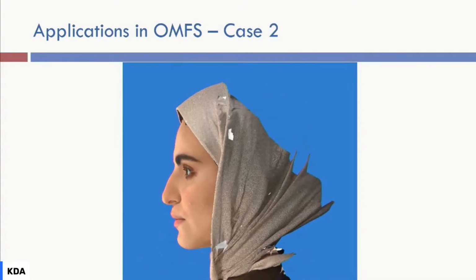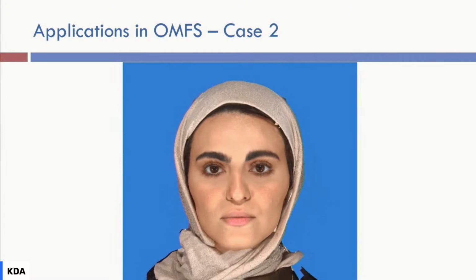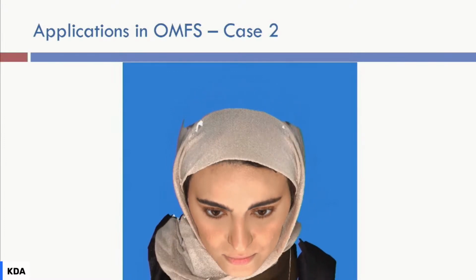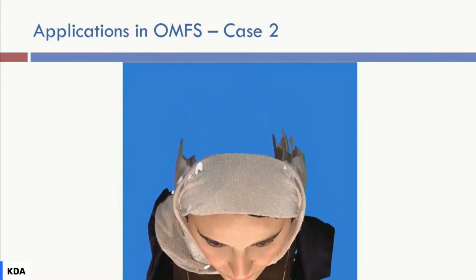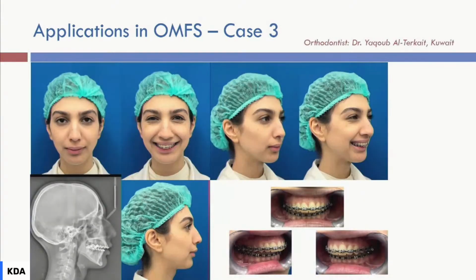This allows me to look at the symmetry of the result, and then allows the same picture to be compared to the pre-op and look for, in terms of research, you can compare them and predict the movements and what is the tissue response to your movements. So this is what I've been using the facial scanning for.